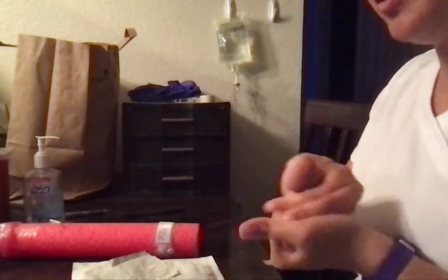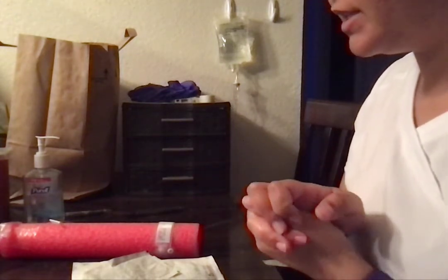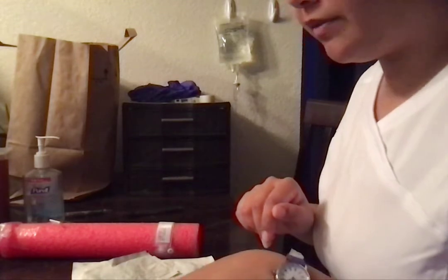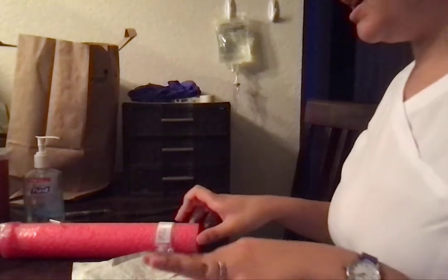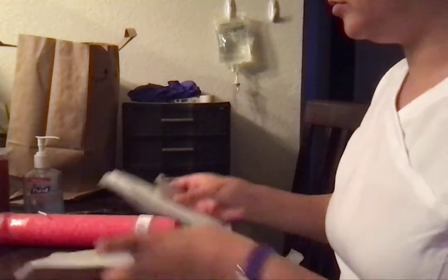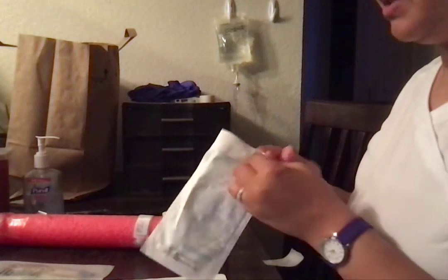Millie, can I please get your first and last name as well as your birthday? Yes, my name is Millie Larson. My birthday is 1/1/1936. All right, that matches my MAR here. And the medical ID number of 123456 also matches. Okay, thank you so much. So I'm going to go ahead and get everything set up. We have our patient here, and the normal saline is running. So we need to keep everything as aseptic as possible.